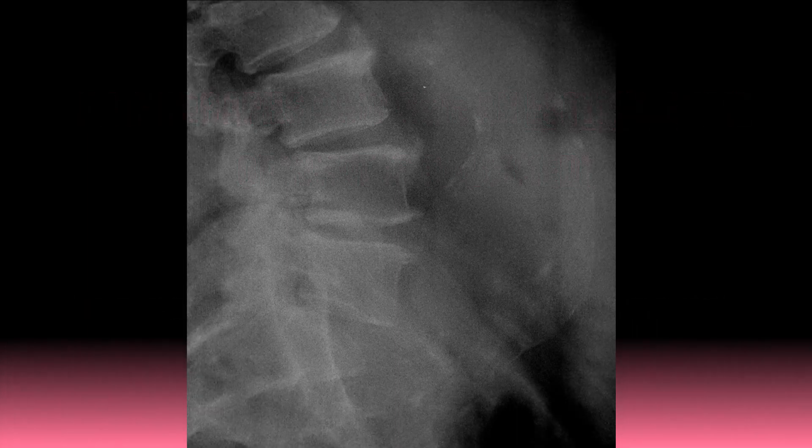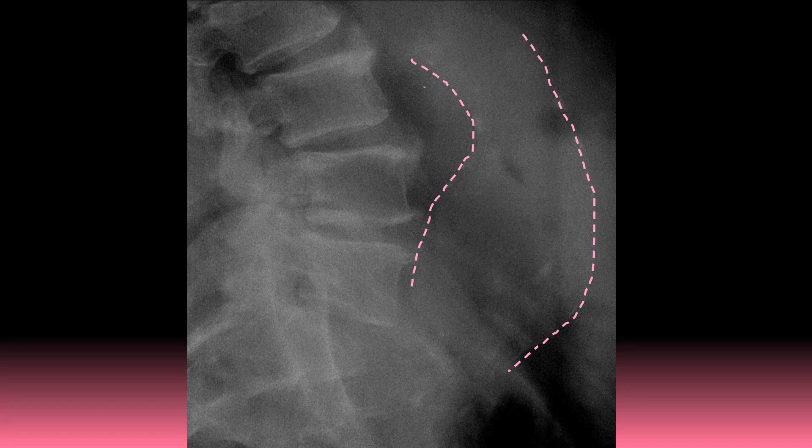Since most abdominal aortic aneurysms are asymptomatic unless they leak or rupture, they are commonly diagnosed incidentally during imaging for other indications. Let's try another example where we locate the visible portions of the atherosclerotic plaquing of the aorta and measure at its widest point.